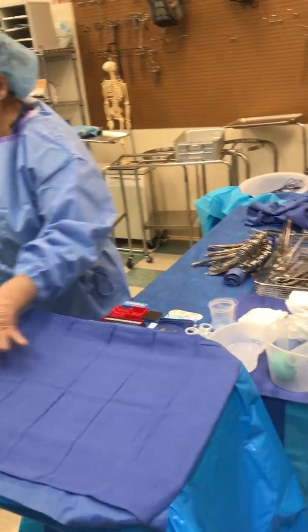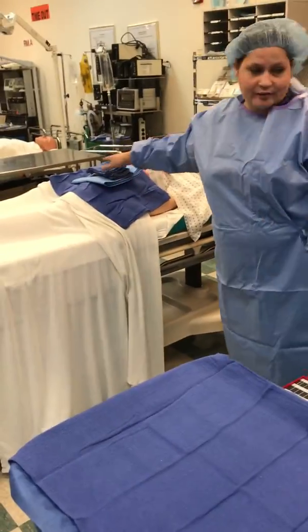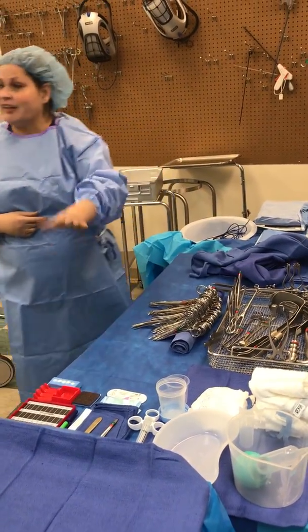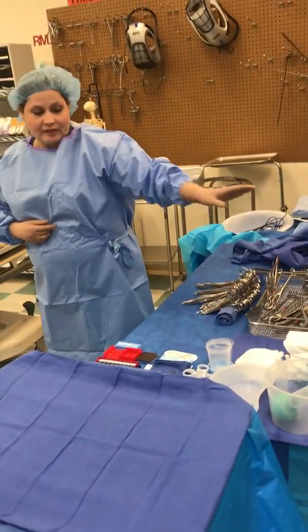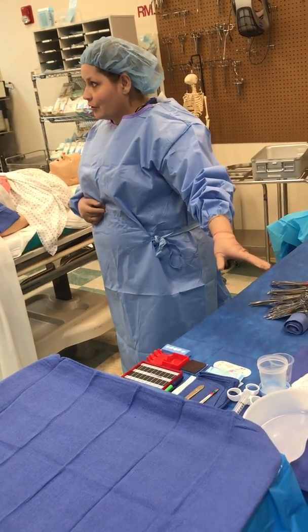So the order of operation is, this was one of the first things I got ready, right? The first thing, because I didn't have my instruments. Once I got my instruments and I got it ready, I need to get ready to count, correct?